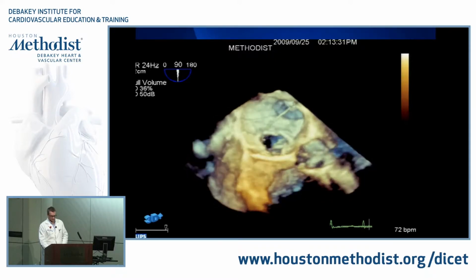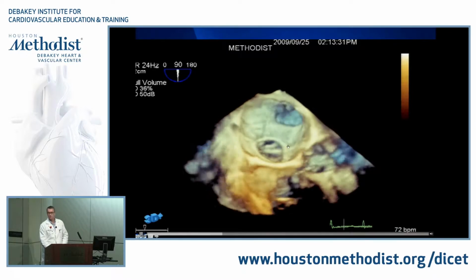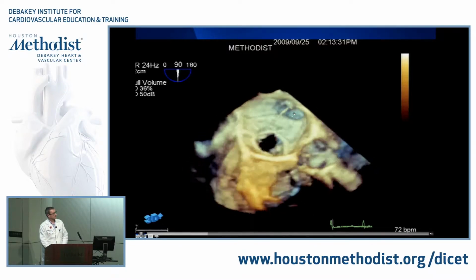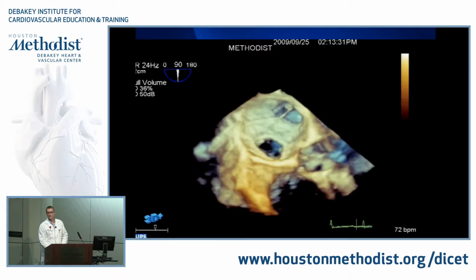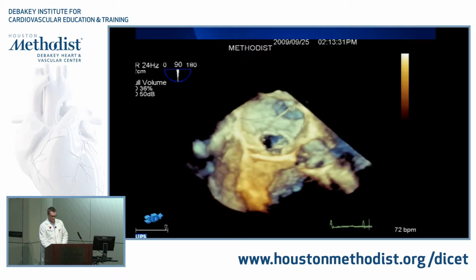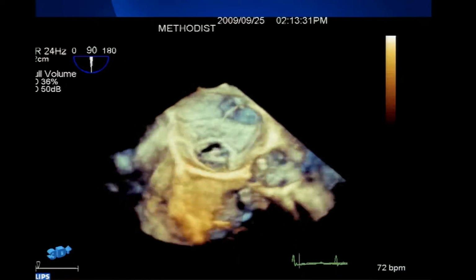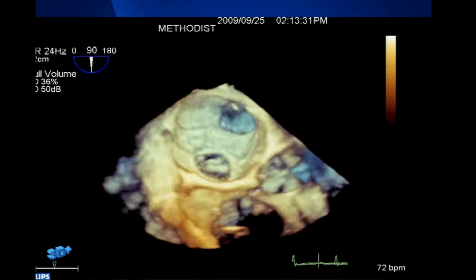This is a different case. This is another example of somebody post-mitral valve surgery, has a complete ring, has a long linear strand. What do you think that is? Okay. So it's mobile, so it meets the wiggling criteria. It's mobile, it's very linear. There's no bulk to it at the bottom. It's kind of uniform. So it's bizarre.